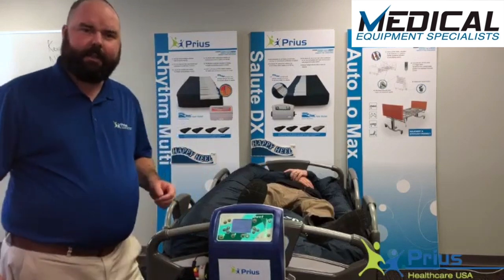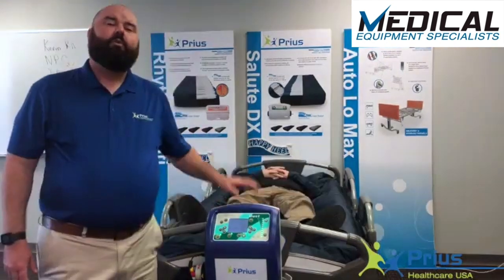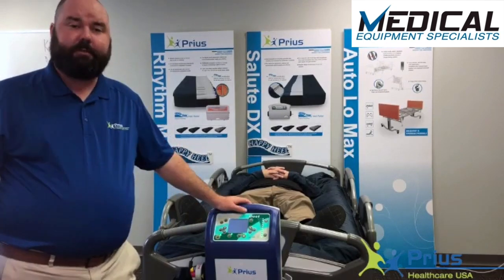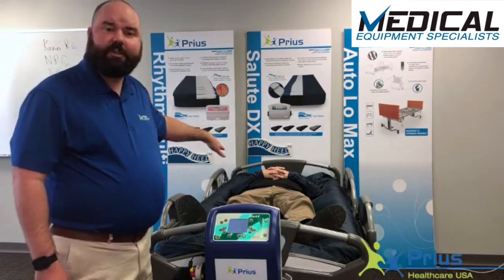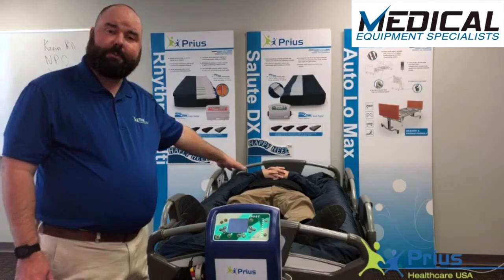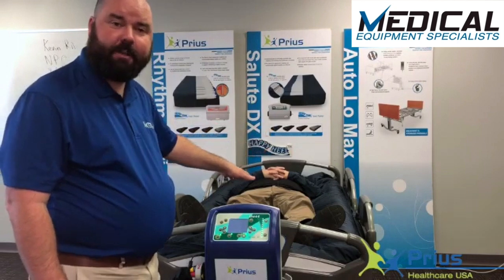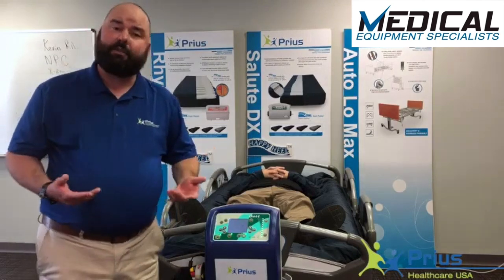With the turning function engaged, starting on the left-hand side, the patient is now at a true 40-degree turn. When the patient is in continuous lateral rotation mode, they'll turn in each phase based on the number of minutes input. For example, at five minutes: the patient is up on the left for five minutes, returns to the rest position for five minutes, goes up to the right for five minutes, back to rest for five minutes, back to left for five minutes, and it keeps that progression in perpetuity until you change the controls.